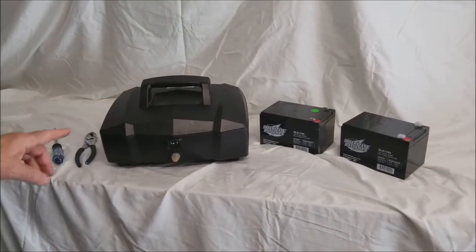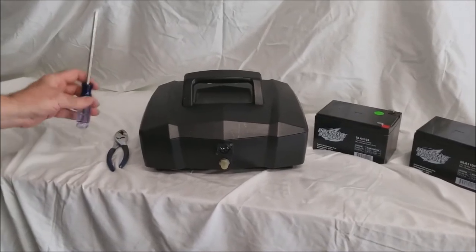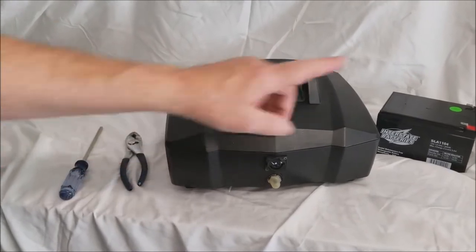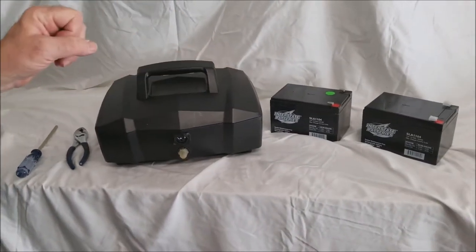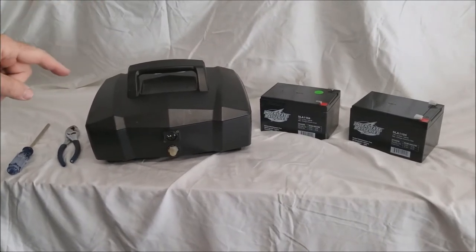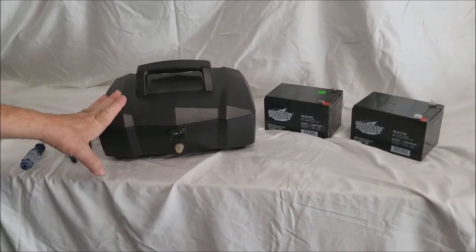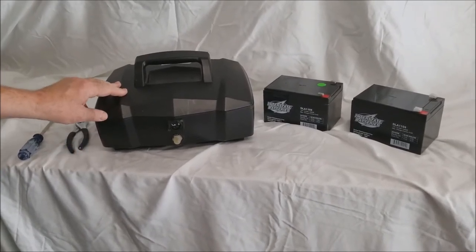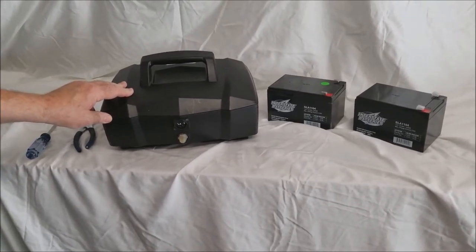To do this, you're going to need two tools. You're going to need a Phillips head screwdriver, and you're going to need a pair of pliers. You won't need the pliers with this kind of a battery pack, but with another style of battery, you might. You'll see it when you get into it. So this is a battery pack that we've determined needs a new set of replacement batteries. I'm going to be showing you how to open it, replace the batteries, and then close it back up again.